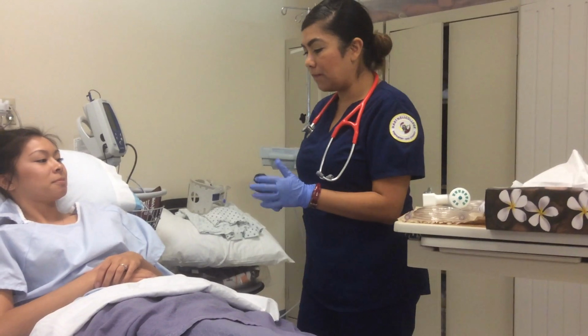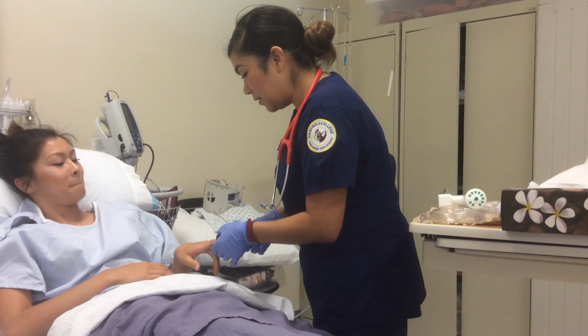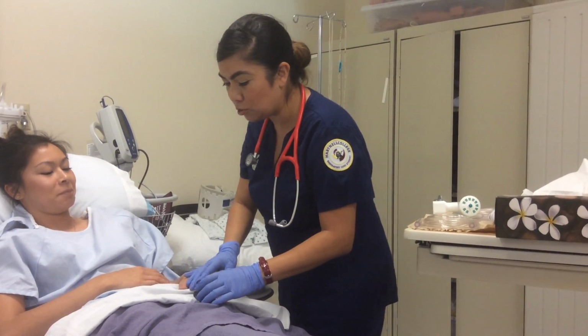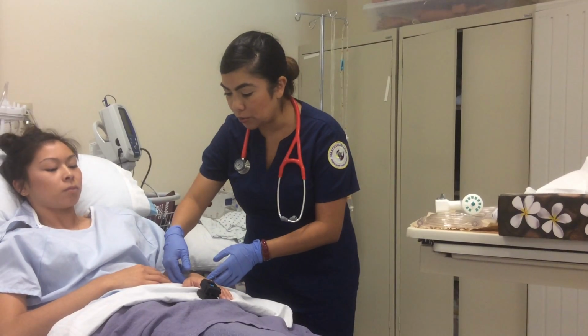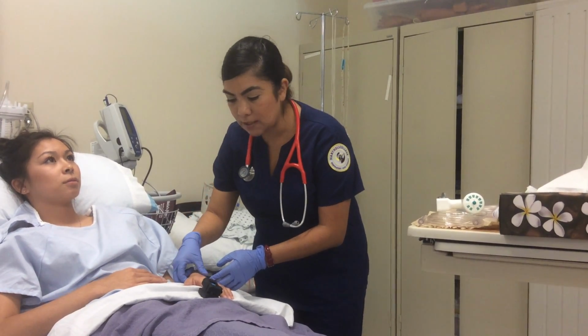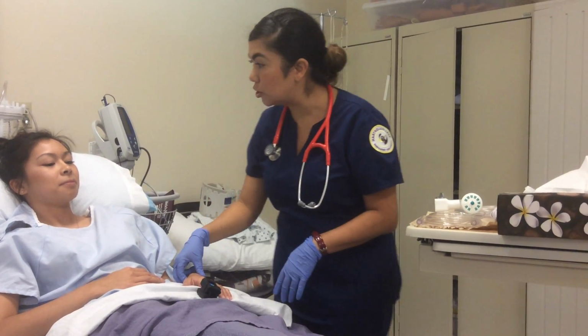If I could have you place your index finger in there. Very good. It's going to make some beeping noise. If you could just relax. And then I'm just going to check her pulse right here on her wrist, just to make sure that it correlates with the beeps right here. Okay, and I just want you to relax, please.